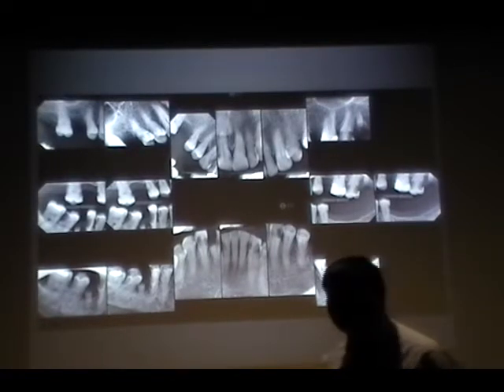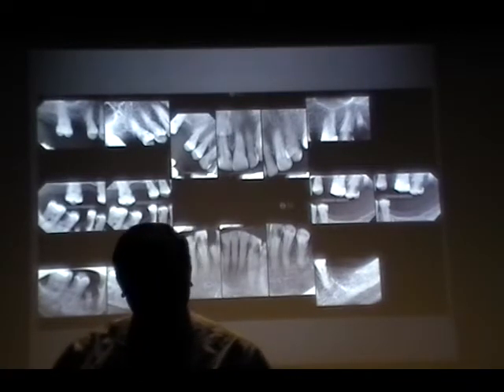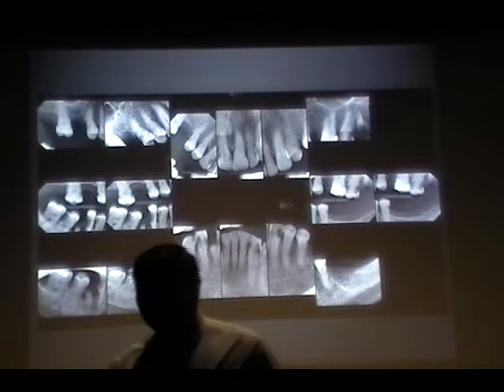I can't see the crowns on this image. Also, I don't think they even have the right teeth. They're supposed to have the distal of the canine, but I see molars. That's way too far apical, so it cut out the crown. You guys did not have breakfast, or is it you guys talk very low, or in my class you guys are talking very low, so that I can't hear anything. It's too far apical, so the crown got cut off. Ha! That's very good.